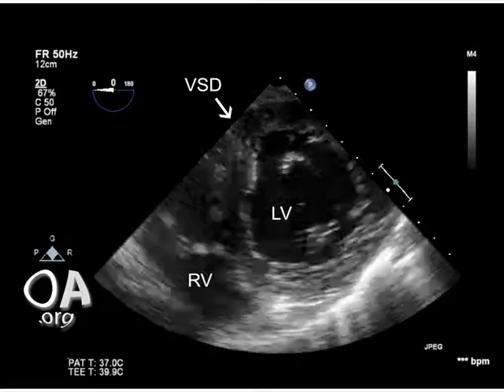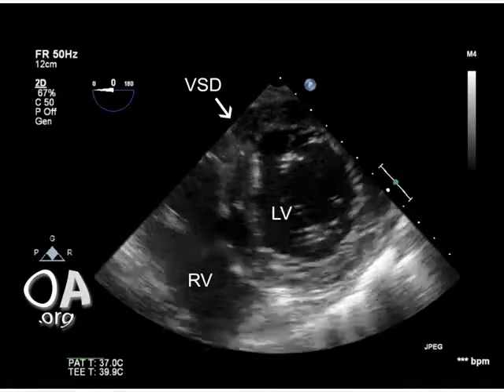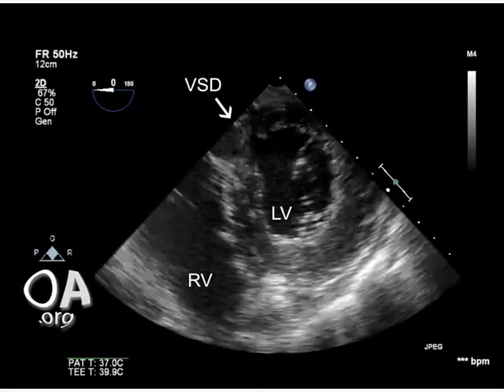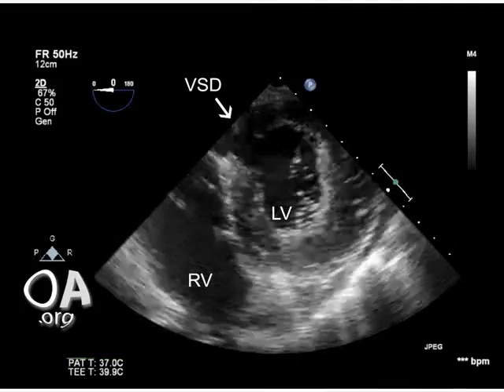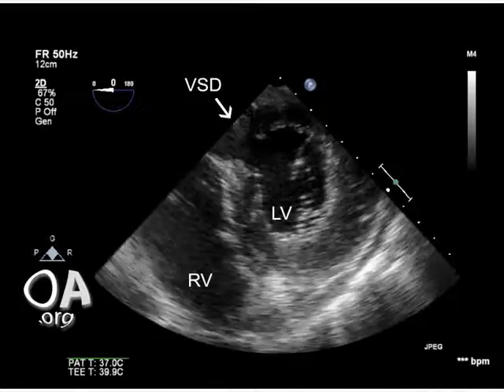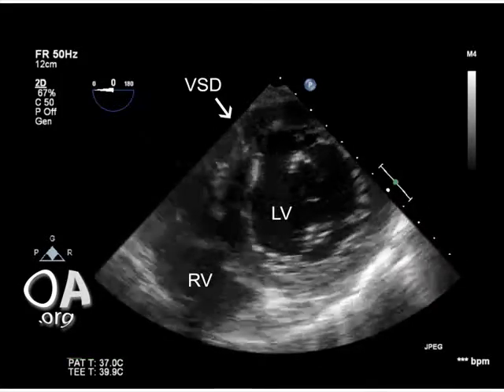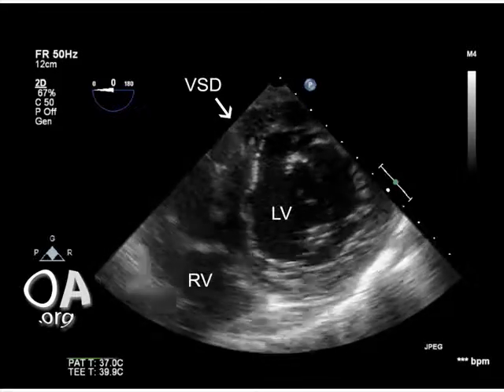This is the transgastric basal view with the mitral valve leaflets noted within the left ventricle for our patient. It is especially helpful to look at this view in order to see the large VSD near the top of the scanning sector. It is labeled as VSD. Thus, the location of our patient's VSD is in the infero-posterior portion of the interventricular septum at the basal level, corresponding to severe sustained myocardial ischemia and infarction of the inferior wall due to right coronary artery occlusion.